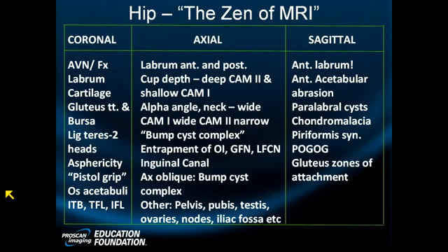So what might do that? He's obviously a very muscular, vigorous, athletic person. He's got almost no body fat. So it could be that he's just a gunner. He's just a tough guy. But you might also have to consider situations that place him at increased risk for muscle tear. And he has one of those situations.